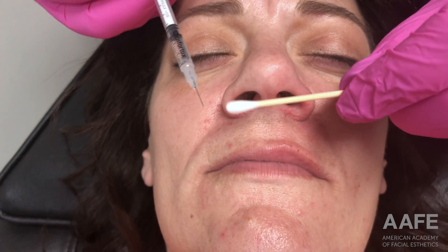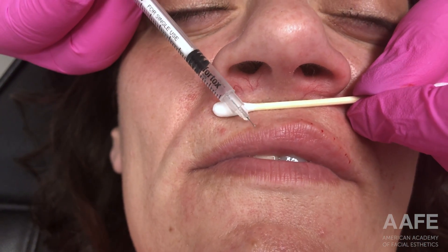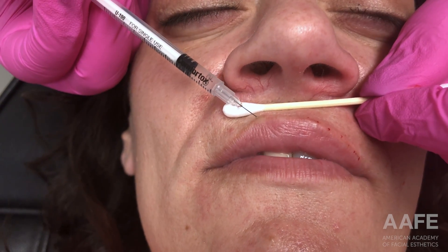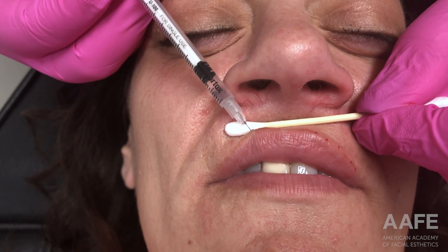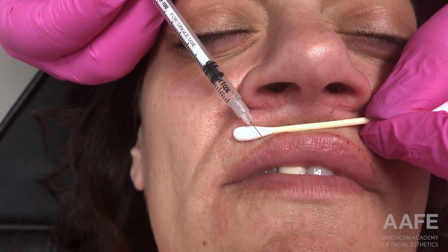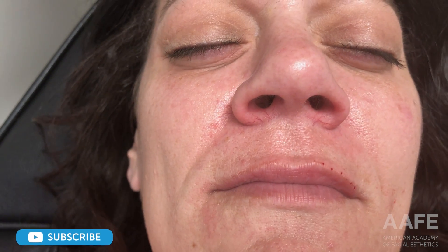You can see that even using a very small amount of product still really lifts up and gives the lip a beautiful appearance. This is this patient's very first time getting her lips done, which is always exciting for an injector because we're starting fresh on lips that have never been touched — not worried about old product or other injectors previously injecting them, causing filler migration, or maybe using a different product the patient isn't sure about.